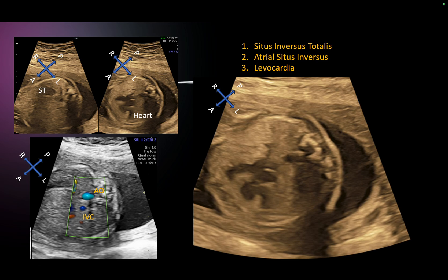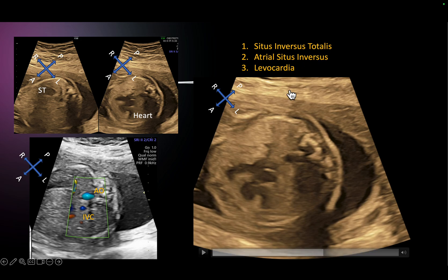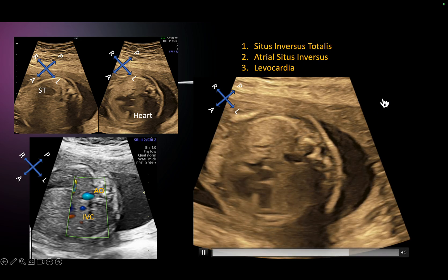This confirms situs inversus totalis — the entire situs is inversed. That is what a mirror image dextrocardia, or mirror image situs, is — we call it situs inversus totalis. The atrial situs is also inversus, but there is levocardia.